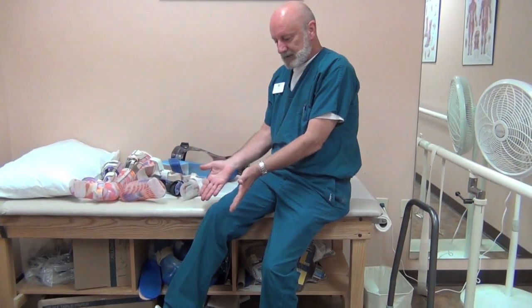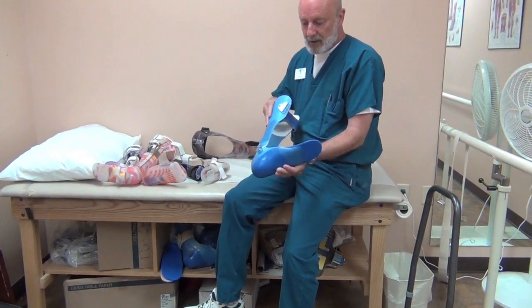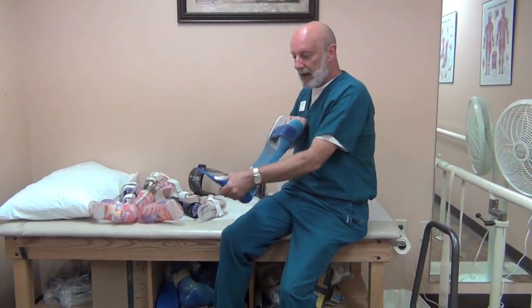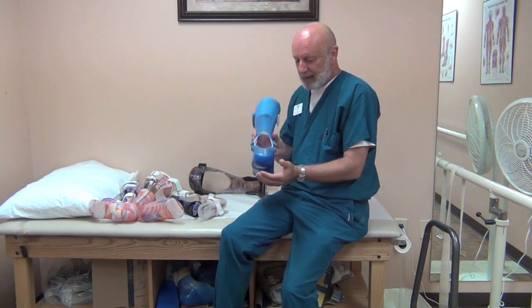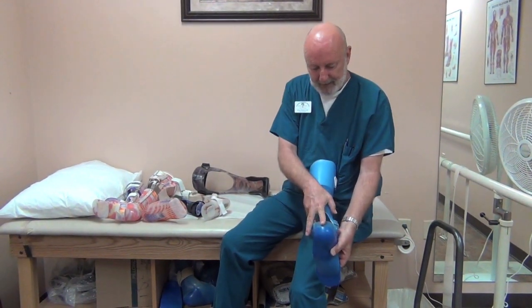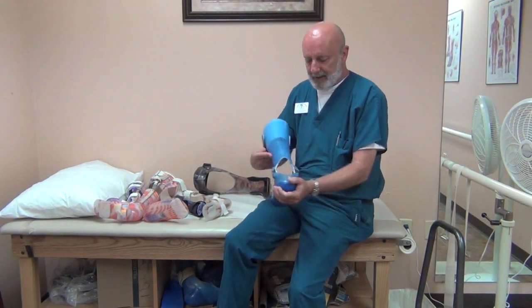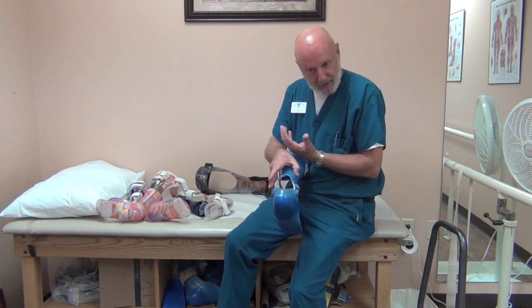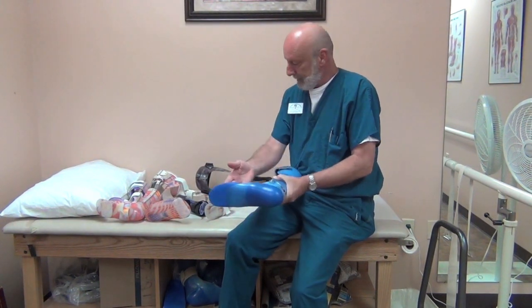If you simply have a deficit affecting the dorsiflexors — the muscles that pick up the toes — you could use a simple hinged design with a spring to pick up the toes, facilitating toe clearance and allowing normal gait so you don't catch your toe when you walk. What's important with spina bifida is having a well-molded foot plate that supports and controls the foot, with the heel vertical — not in valgus or varus alignment.